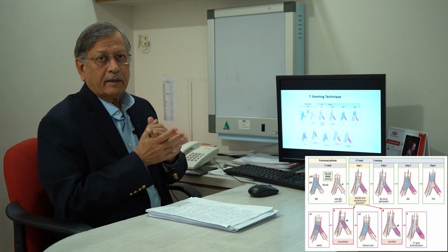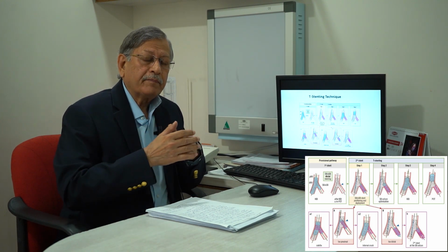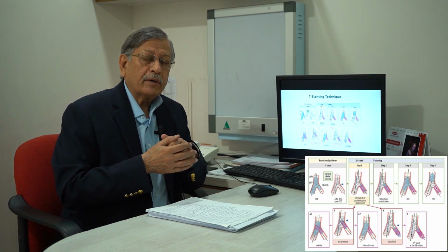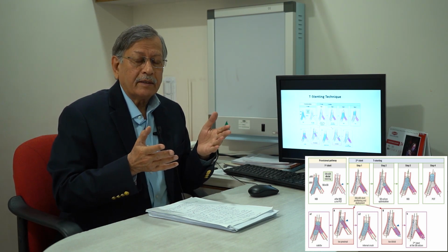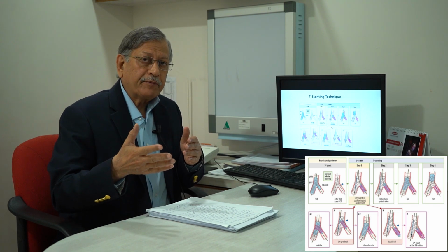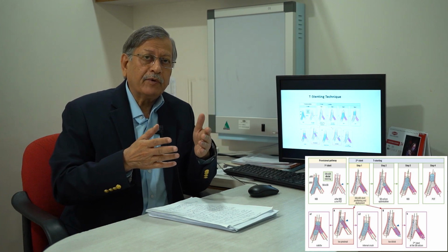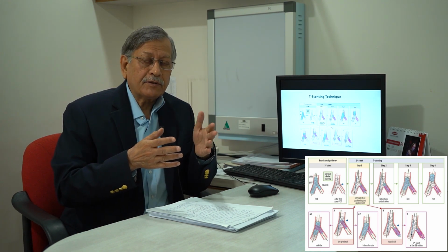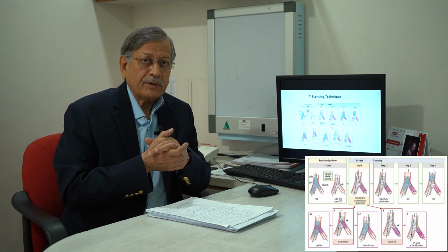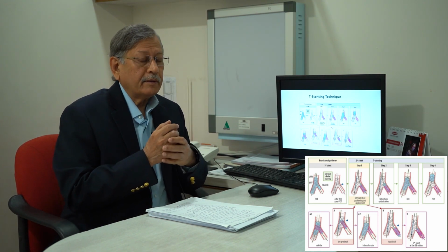Then what do you do in provisional stenting once you decide that you need a second stent? For the second stent, the default strategy is either T-stenting or TAP stenting. These will remain our default strategy for provisional stenting in those cases where we require a second stent. Now, when do we require a second stent? If there is a significant plaque shift which does not go away with simple ballooning, that is one. And number two, while you're opening up the strut or ballooning, if there is a significant dissection, all these patients will need a second stent provisionally kept.